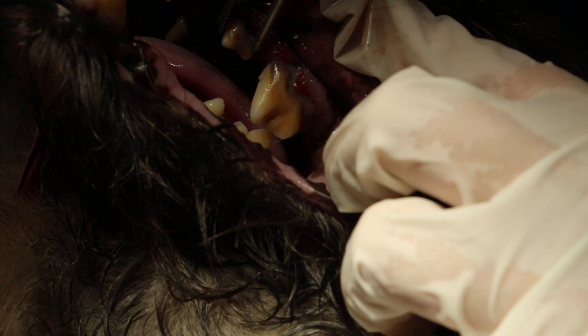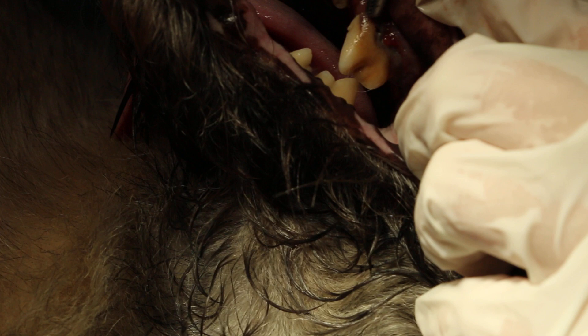That is the premolar four — we are pointing at the premolar four. Now this premolar three is loose. Premolar four is still strong, but you can see the roots are exposed. The molar one is gone — I think the molar one behind, they're gone. They were taken off last year.